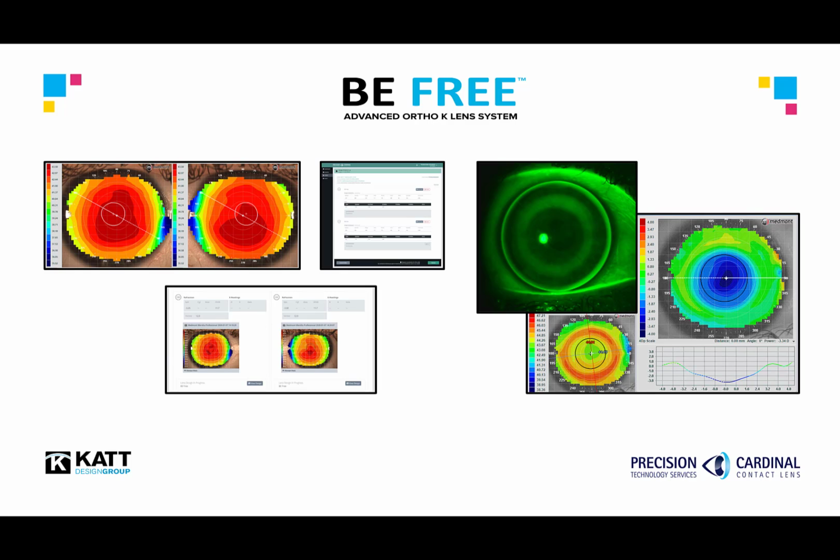With accurate corneal topography data, the correct parameters are constructed for the patient, and that assures the highest first fit success possible. Therefore, the pre-fitting corneal topography is very important to the success in Ortho K.